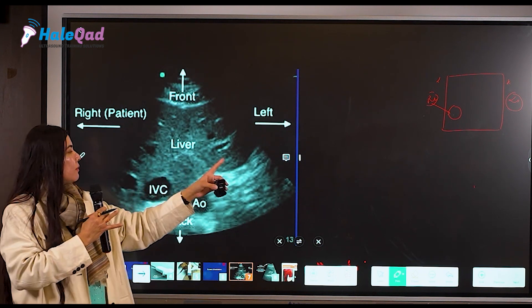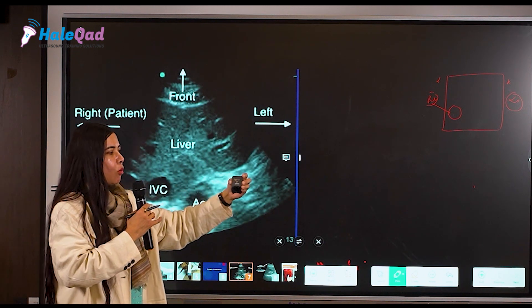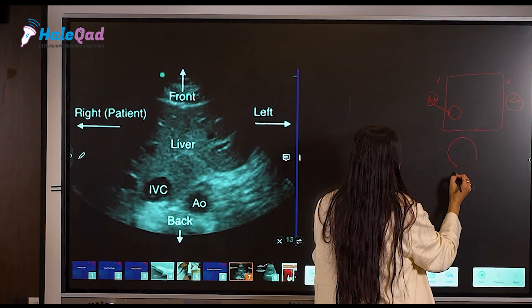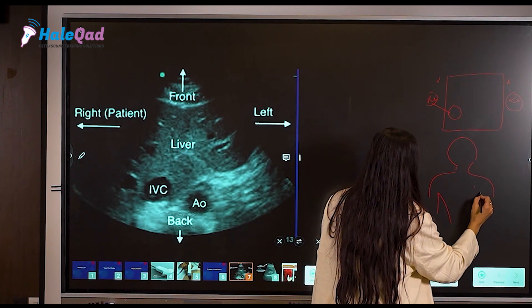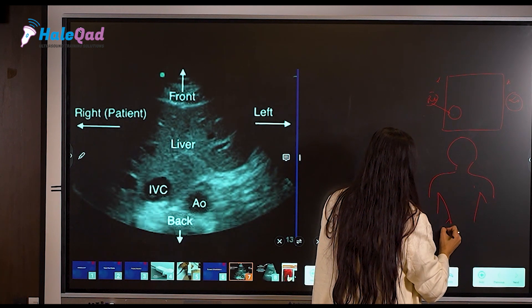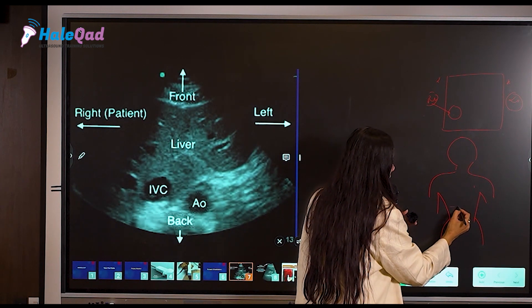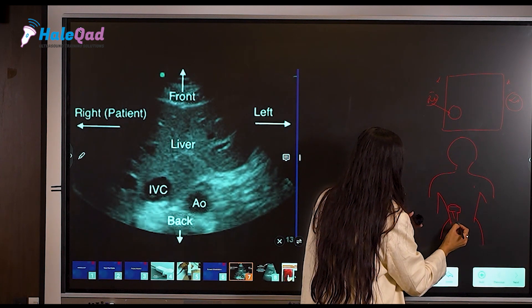You have to move the probe thoroughly and scan the said area completely. There are proper movements — sliding movements, tilting movements, and others — which we'll discuss in screen orientation. When I'm holding the probe like this and I want to scan the abdomen, I put the probe in a transverse position.